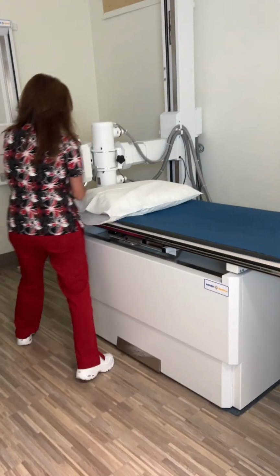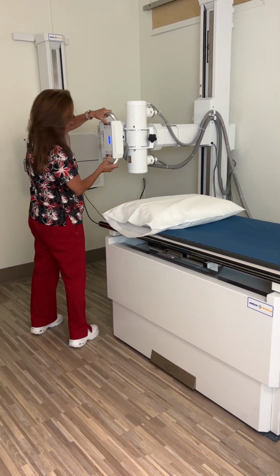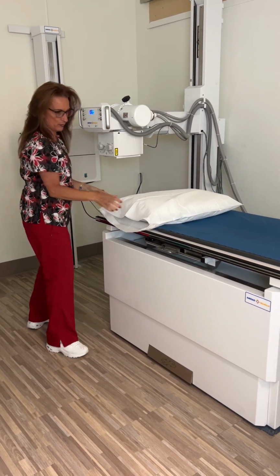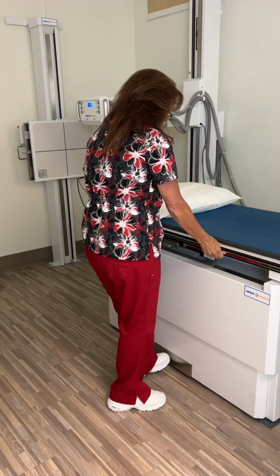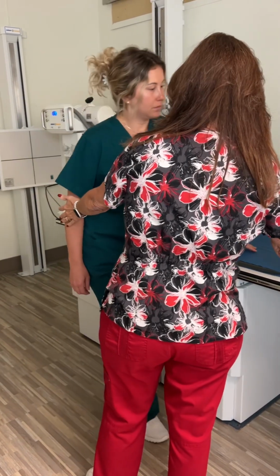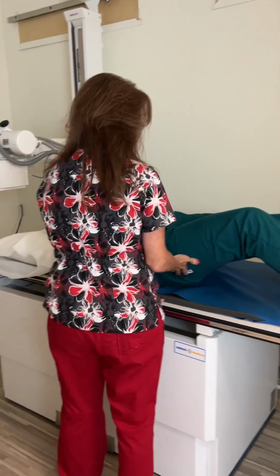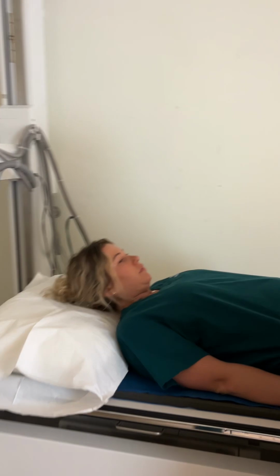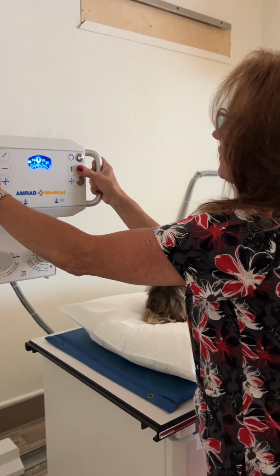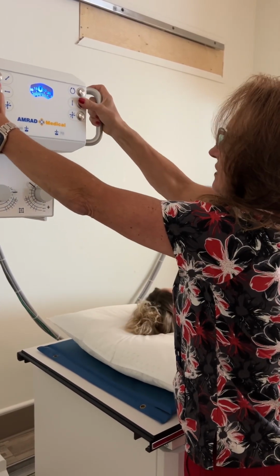So, move this out of your way. All right, we'll let you come over here and have a seat on the table for me if you can. You just lay on your back. First thing you want to do when you have a patient on the table for any kind of exam is to make sure that they are straight. Make sure they're still in detent.